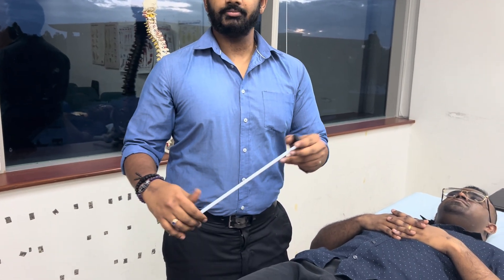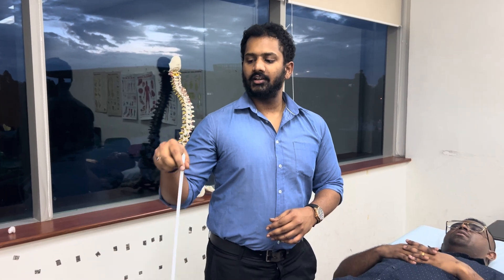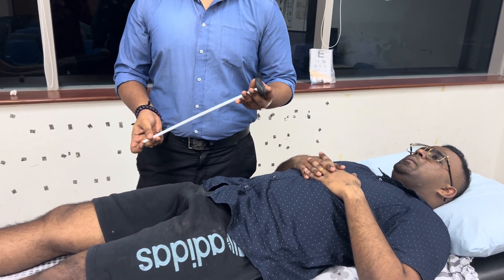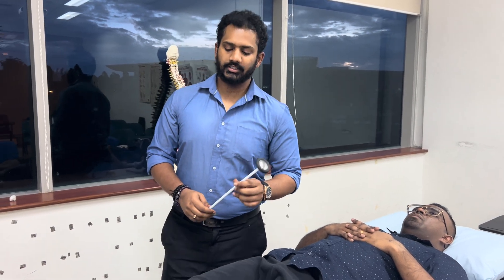There is a reason why this long rod has been given — you hold it here so that you have a secure grip. Do not hold it in a way that prevents you from swinging it properly. What happens is we are applying momentum: momentum is mass times velocity. Velocity is a vector — speed with direction. When mass and velocity are both present, a brisk introduction of that momentum will elicit the reflex we intend to see.